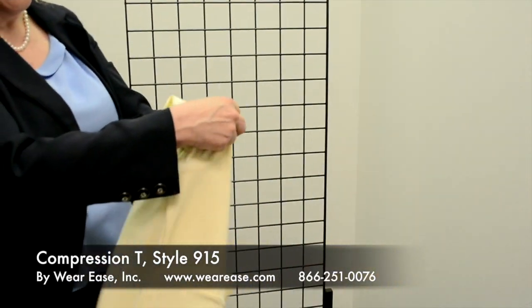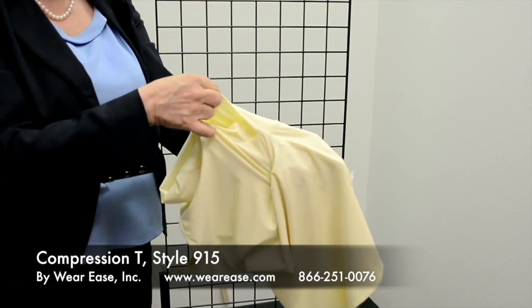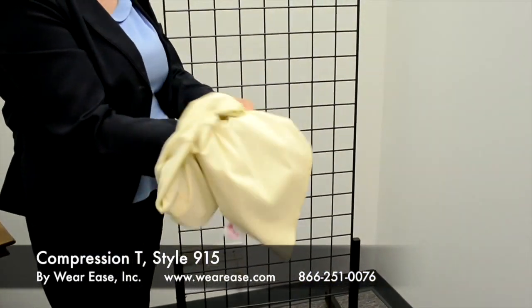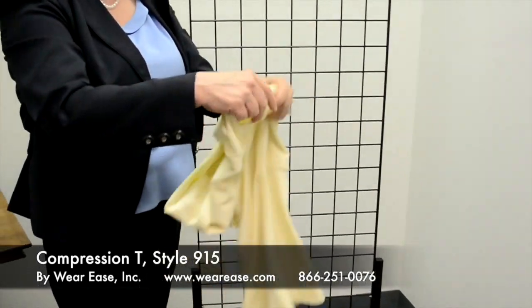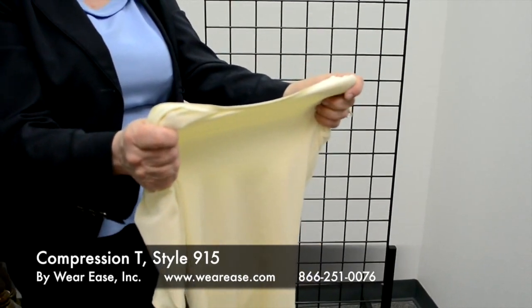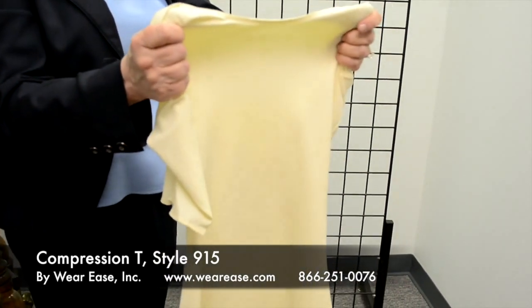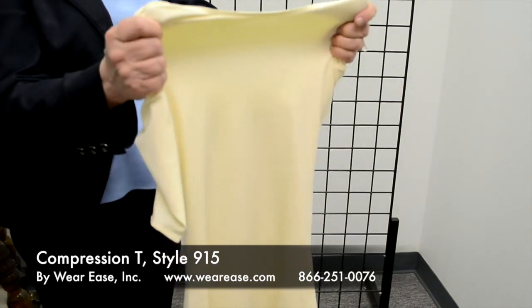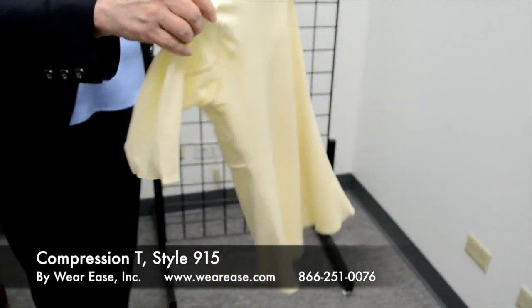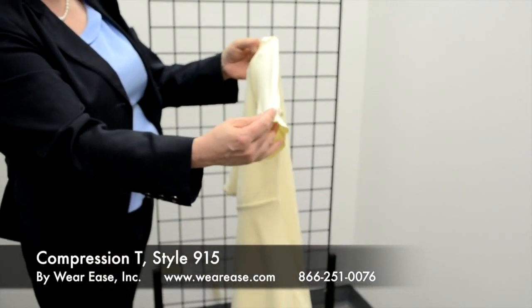This garment also has pockets for prosthesis, chip pad, or swell spot. It has a double back, so it offers more support in a couple of ways: it has a double layer of fabric that provides additional compression for the back, and it has a sleeve, which is unique to this garment.